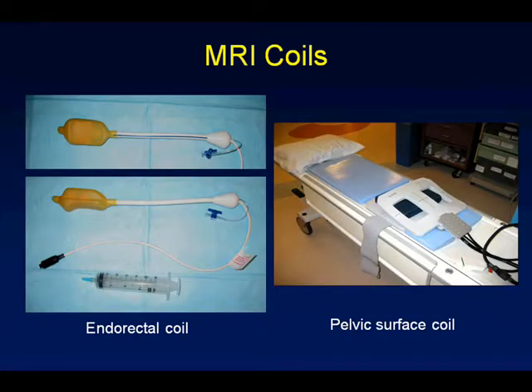Okay, moving on to prostate, and what I'm going to do is cover diffusion and 3 Tesla and finish off with that. So basically, when you do a prostate exam, you can do it with an endorectal coil. This is what they look like. This is a 50 cc syringe, just to give you a relative size of the coil. So this is basically the balloon that's inserted, deflated. This side is applied to the prostate gland.